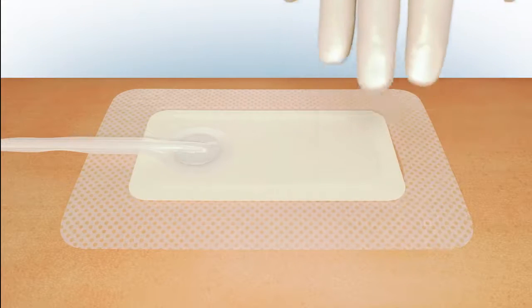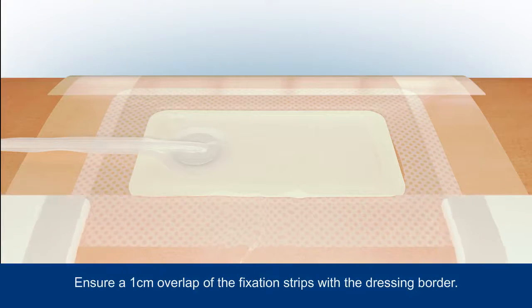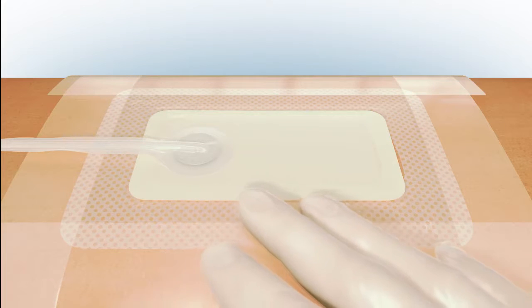In order to maintain a good seal during the wear time of the dressing, apply the fixation strips with a 1 cm overlap to each side of the dressing. Smooth the strips to ensure an effective seal.